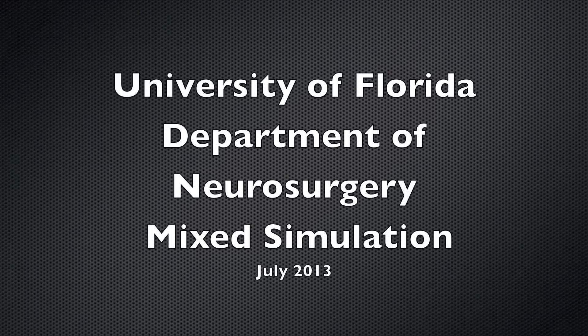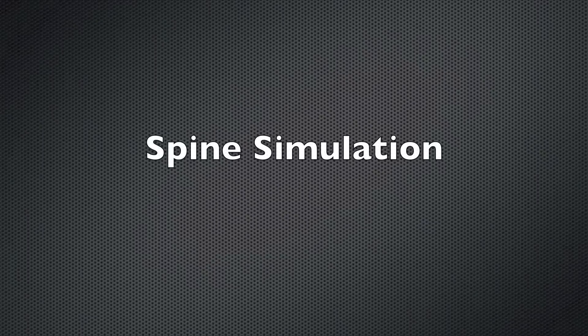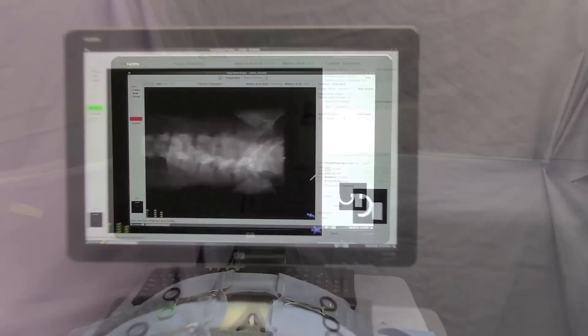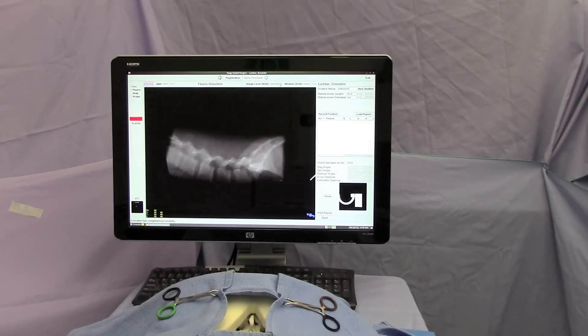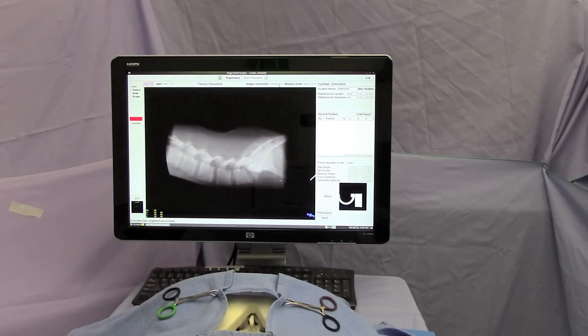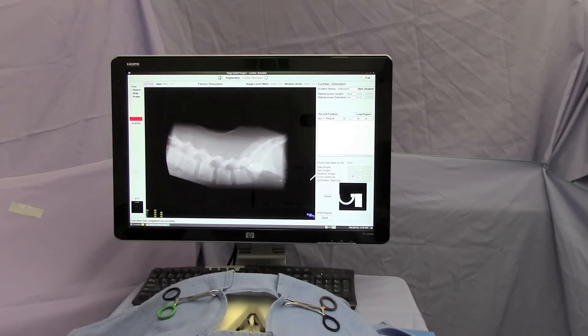This is a demonstration of the University of Florida virtual simulator. We will first look at our spine simulator. In the foreground you'll see the physical model and in the background you'll see the virtual model.